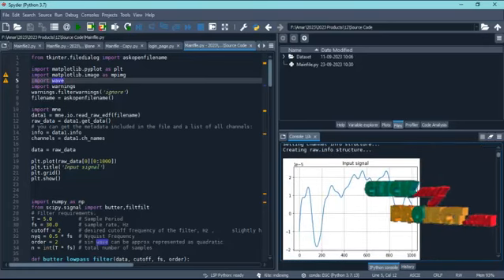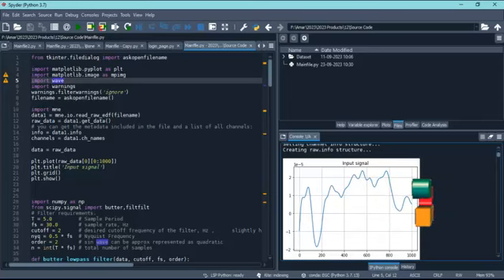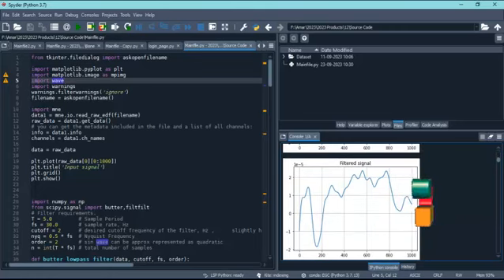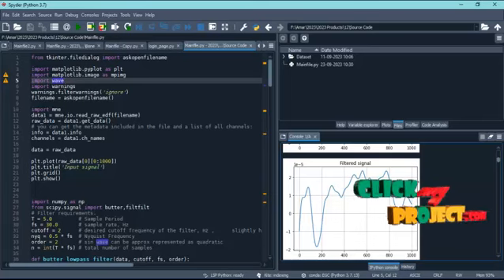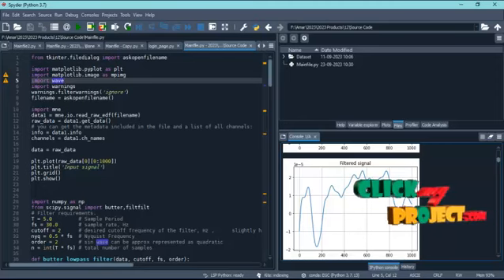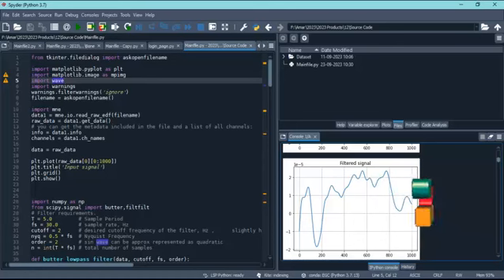Now this is the input signal which we have taken from the dataset. The user-selected signal is here. After the selection of the input signal, the pre-processing will be carried out. In this pre-processing, as we have already discussed, the filtering is applied to remove the noise from the signal. So here the noise will be removed by using the filtering method, the Butterworth filter.